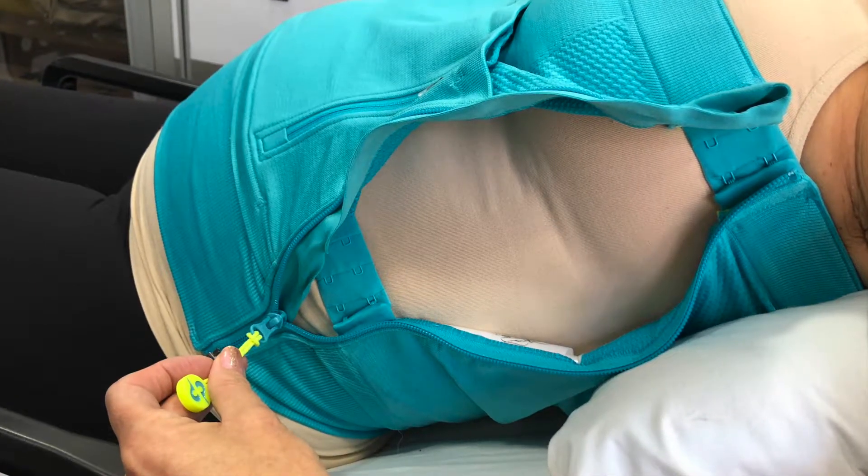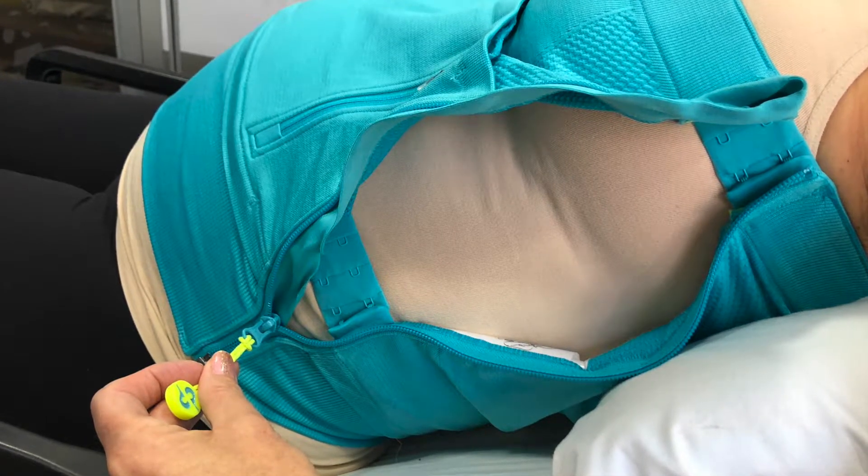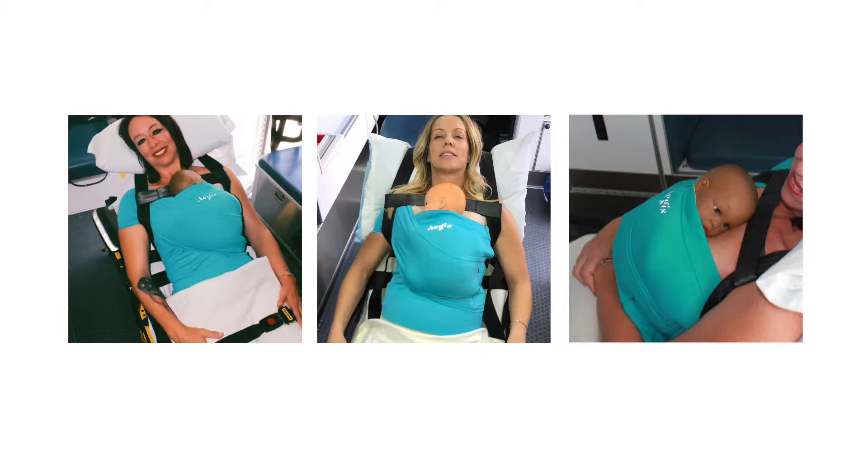The Aegis Wrap does not interfere with tubes or lines for assessments, treatments, or monitoring. Most importantly, transport both patients with one ambulance and crew. Provide care during transport consistent with hospital maternal care protocols. Skin-to-skin contact will reduce stress for mother and infant and promote development of a healthy microbiome for baby.